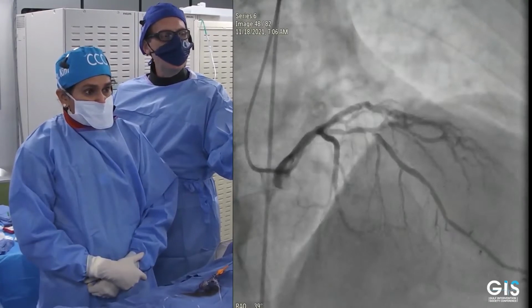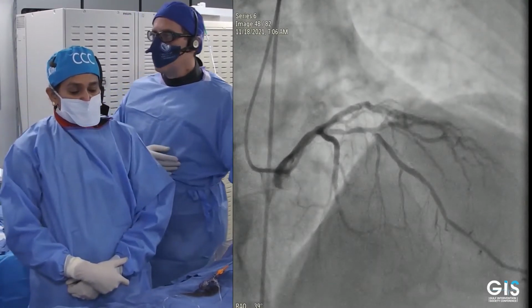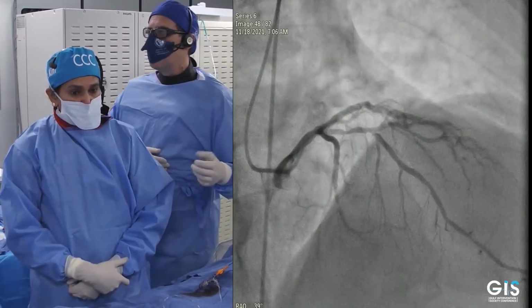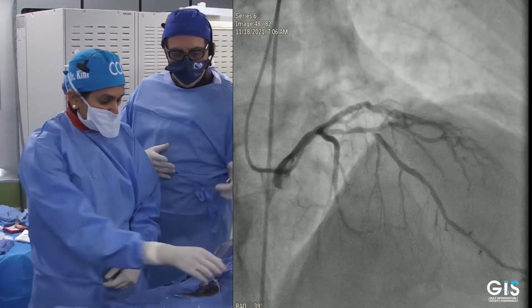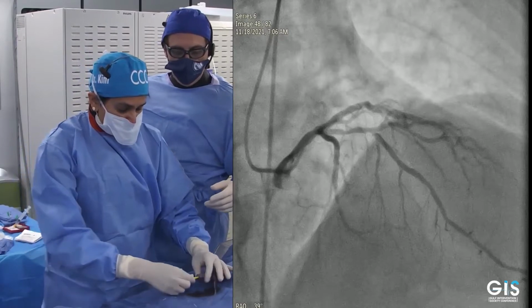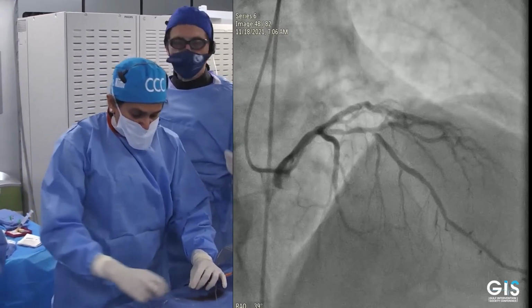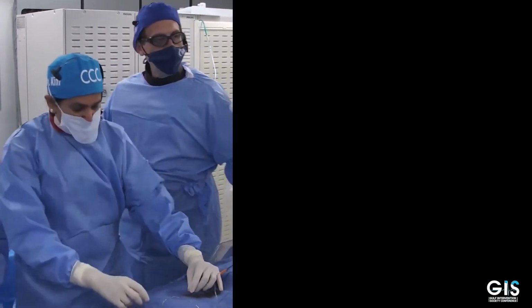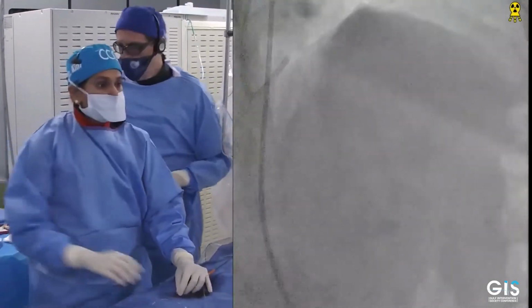a little bit after the ostium, after the takeoff. So, obviously we need to think about that. We would like to do some imaging in preparation of the procedure, and maybe we get a chance to do the imaging and also explain the imaging via the special app we have here, and present you the chance to see how to use the app in order to help everyone understand all these OCT imaging pictures. That's what we're going to use.